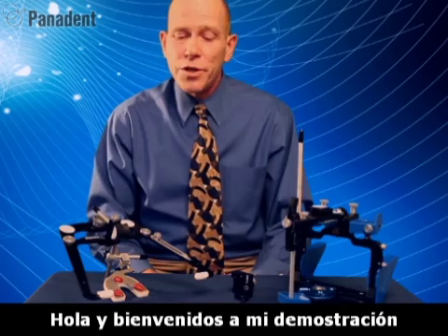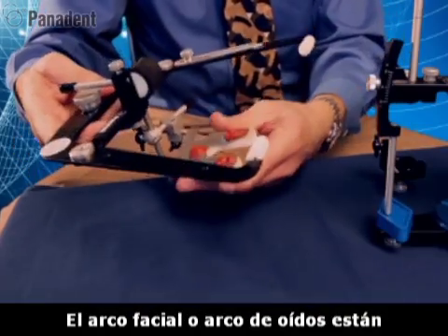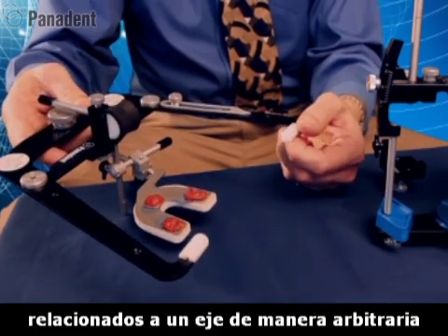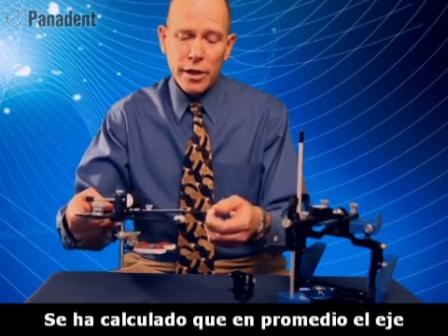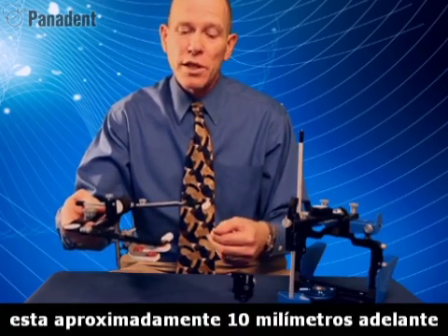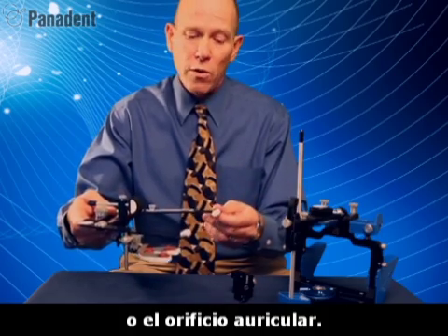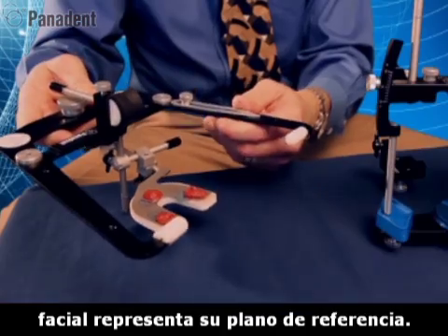Hello and welcome to my demonstration of the relationship of the Panadet face bow. Face bows and ear bows are related to an axis via an arbitrary relationship using the ear holes. It's been calculated that the average axis is approximately 10mm forward and 7mm down from the auditory meatus or ear hole. The whole upper surface of the face bow represents your plane of reference.